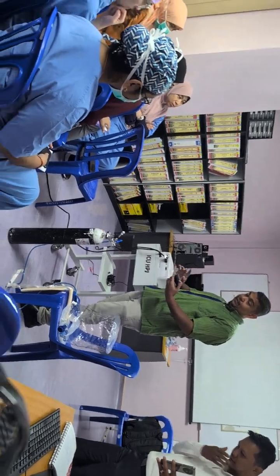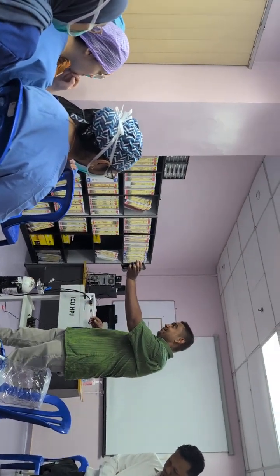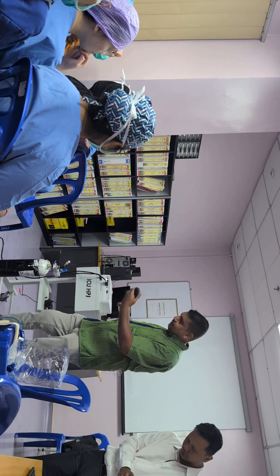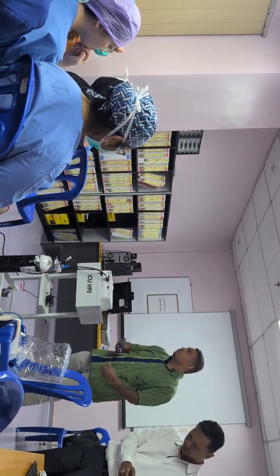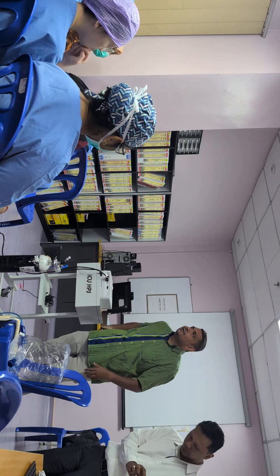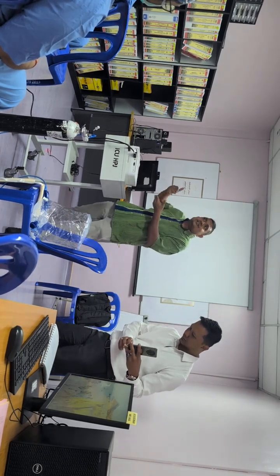This was at 4:22 p.m. Look at our friend smiling. So patient compliance increases for sure, and hence our therapy will meet his or her needs.